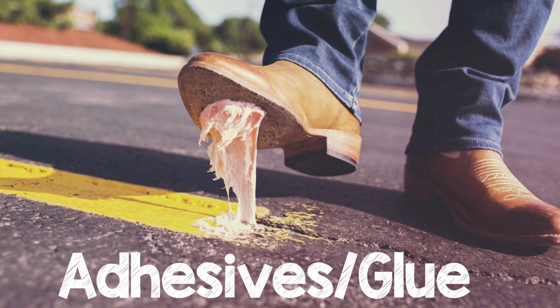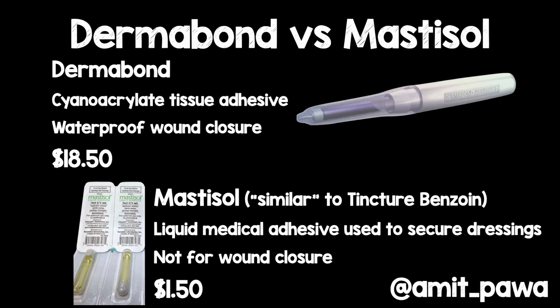People have also talked about the importance of using adhesives and glue. So what am I talking about? I'm talking about using Dermabond or Mastisol, and certainly these adhesives are waterproof and they can significantly reduce the amount of leakage, especially when you're using it for catheter through needle technique. So it's something to consider. A lot of people have talked about using Dermabond to seal that hole and to minimize the risk of any leakage of local anesthetic out through the way. And other people are using Mastisol to help the dressing stick in place.